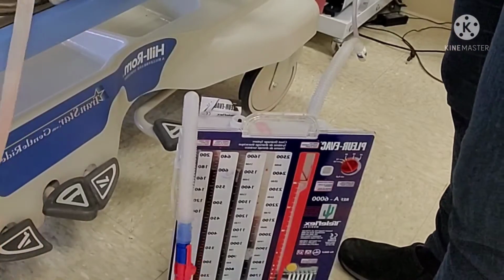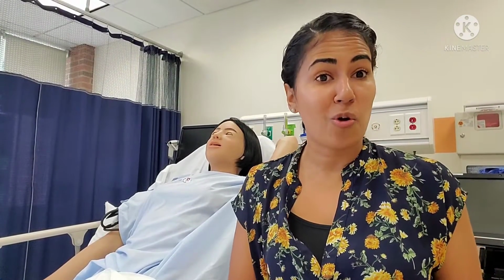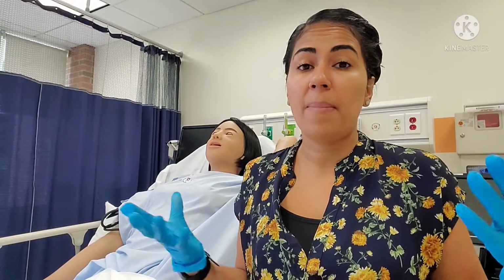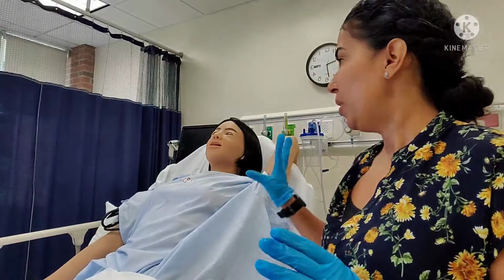Every time I walk into my patient's room, I'm always going to look. Now we determined that my patient has a hemothorax because we see that there's blood draining from the chest tube, okay? So the patient has blood in their pleural space. So we assessed our patient.